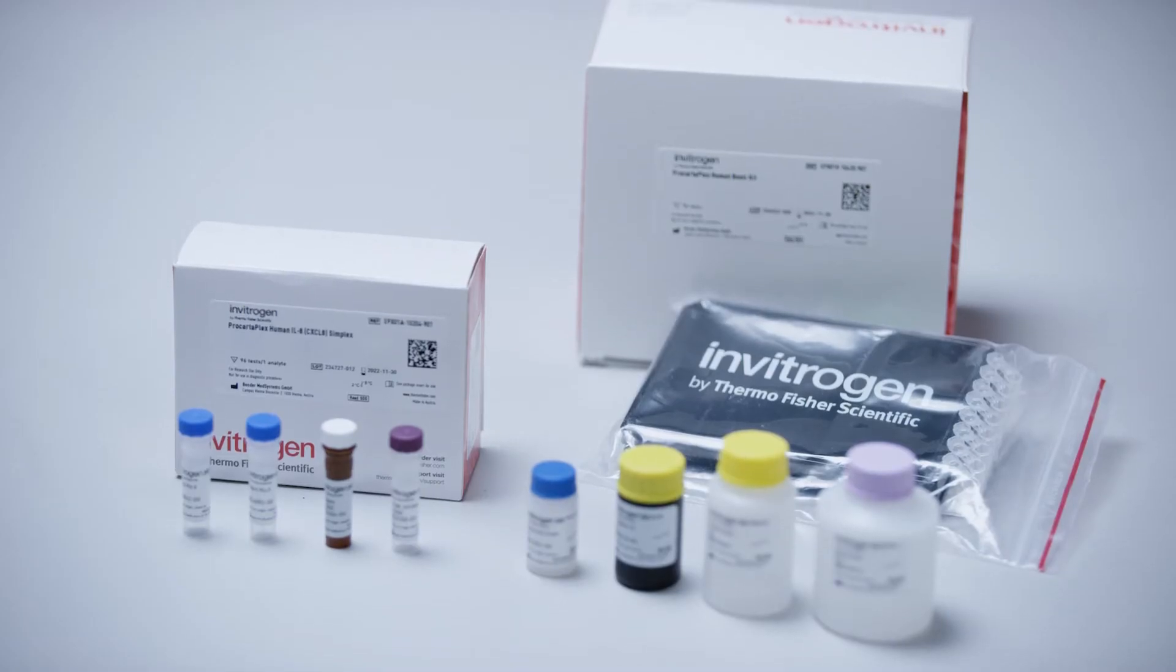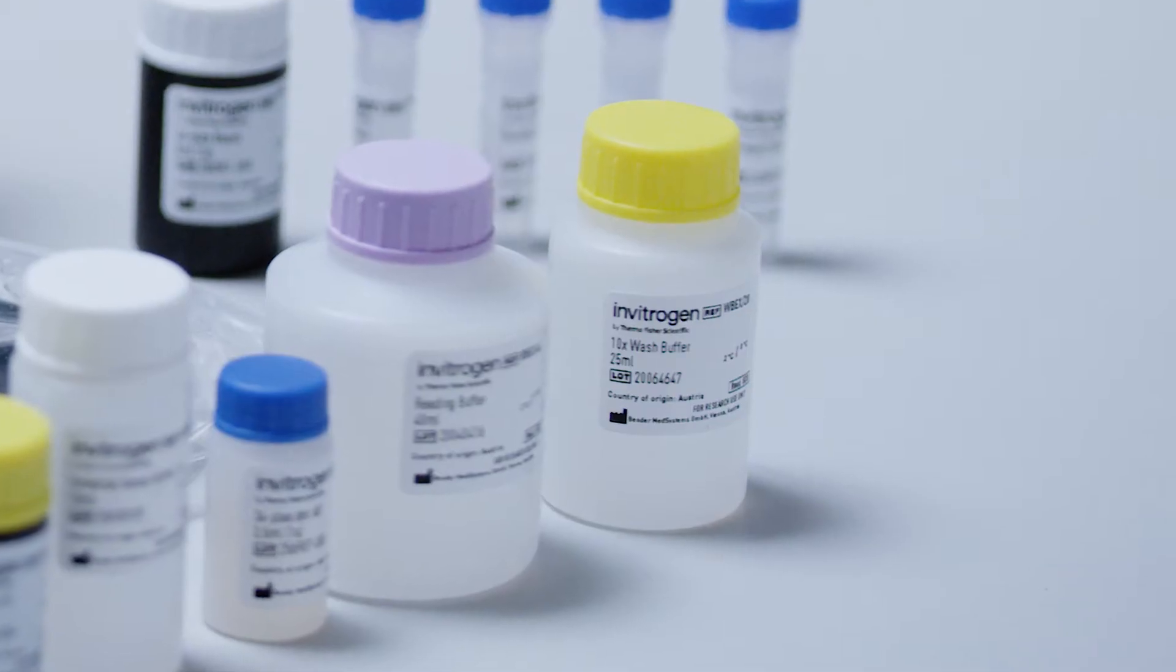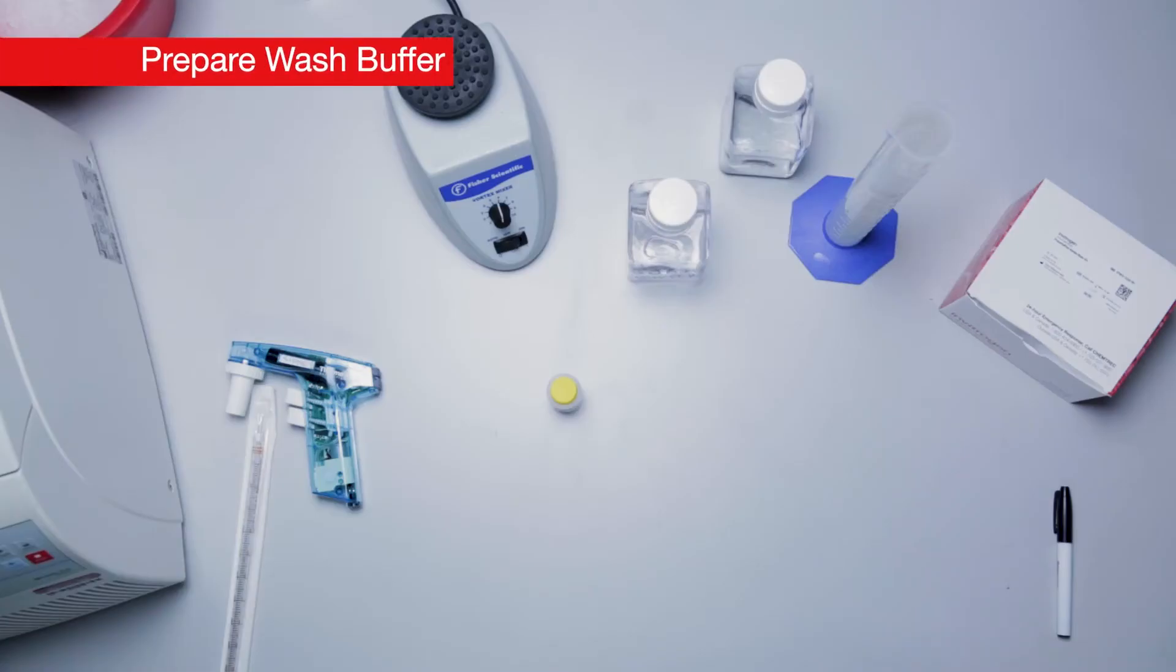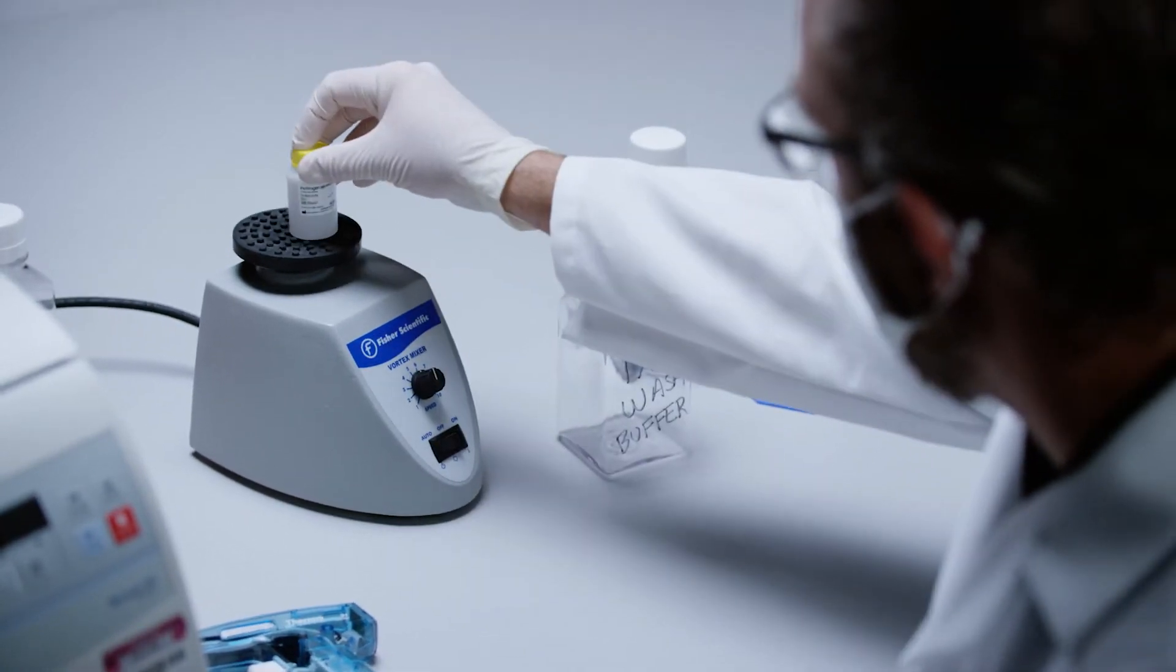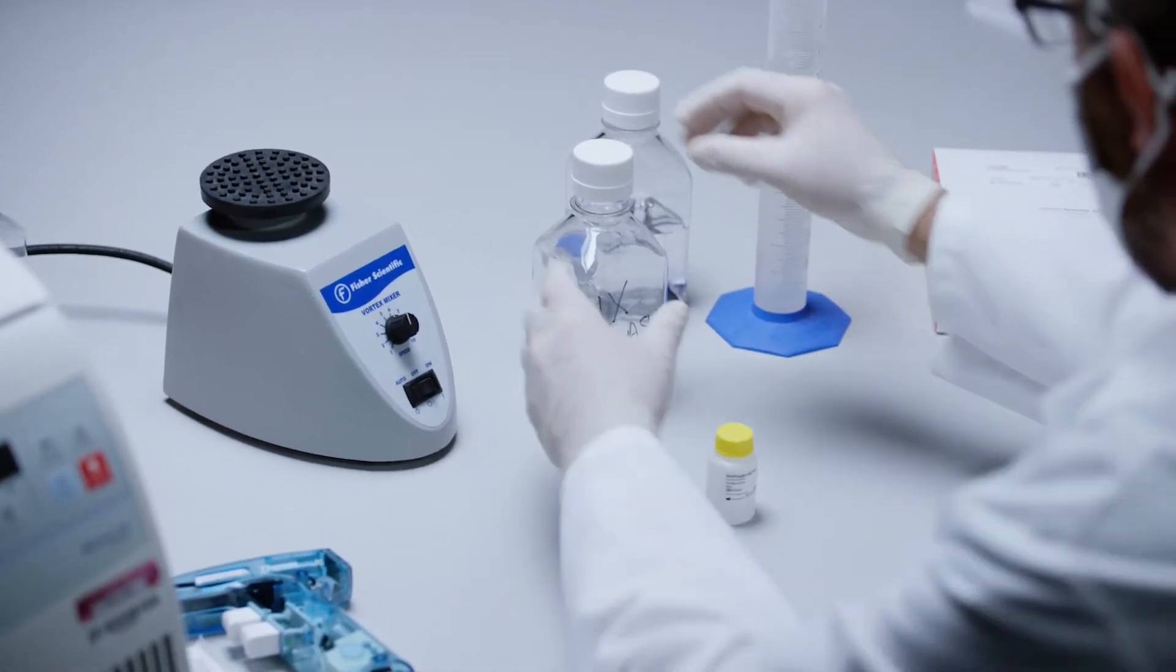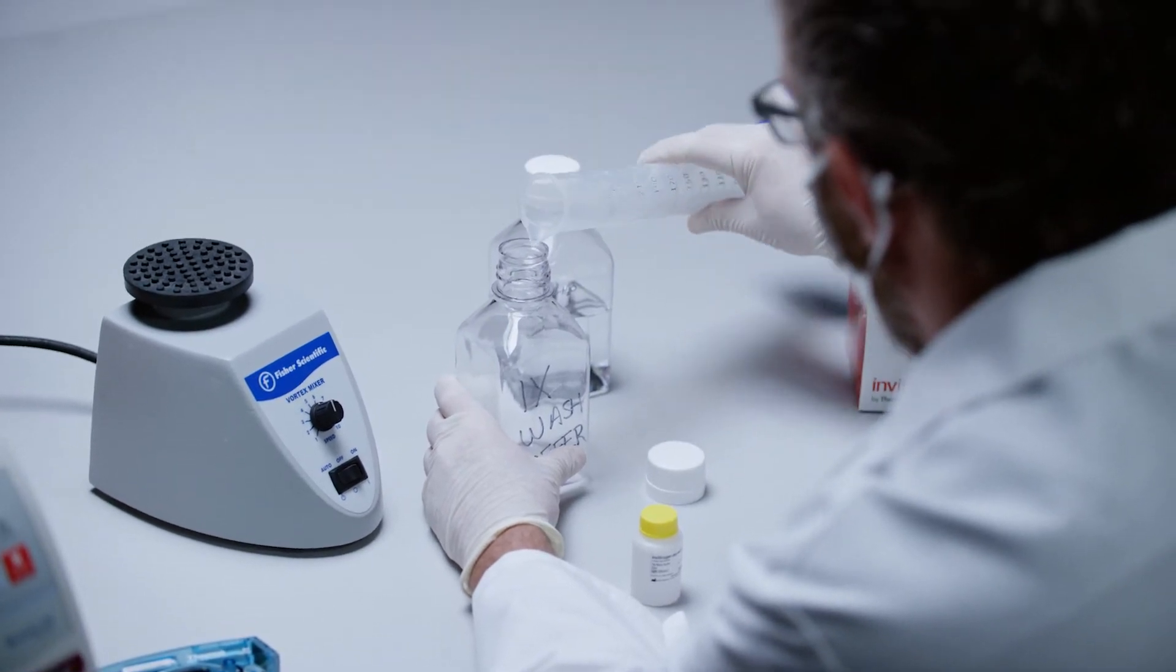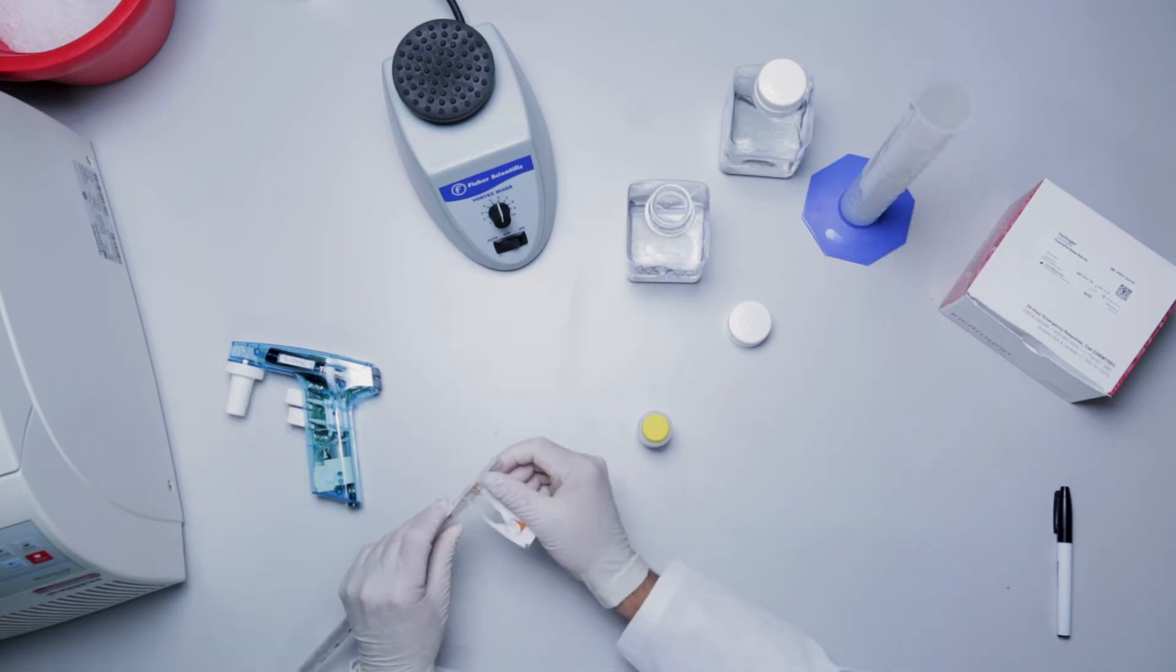Before you begin, bring all assay components to room temperature. Continue by first preparing the wash buffer. Wash buffer is provided as a 10x stock solution. Gently vortex the wash buffer concentrate for 15 seconds. Mix 20 milliliters of wash buffer concentrate with 180 milliliters of deionized water using a 200 milliliter graduated cylinder.